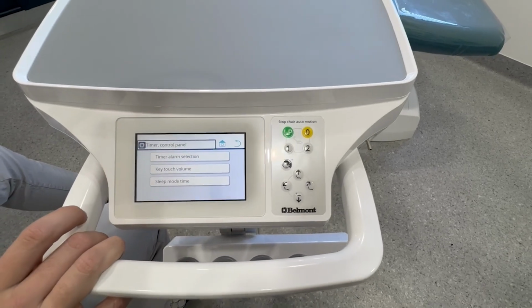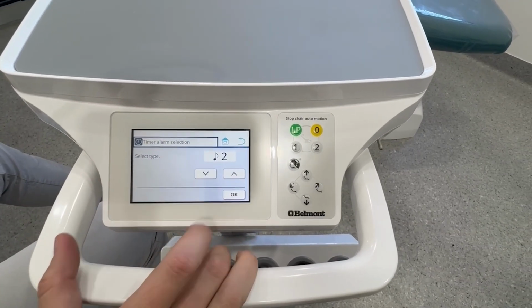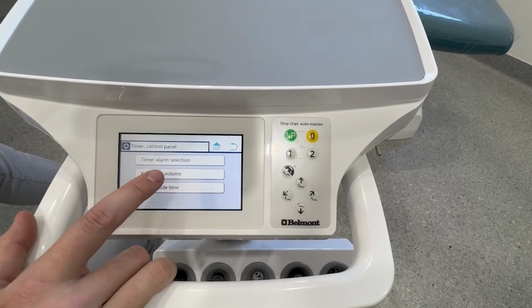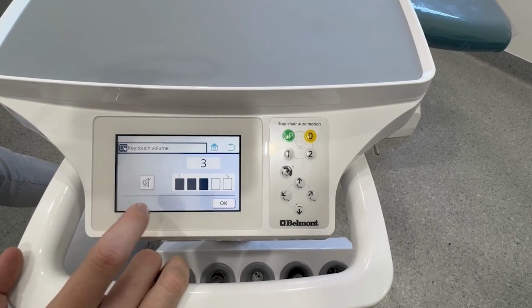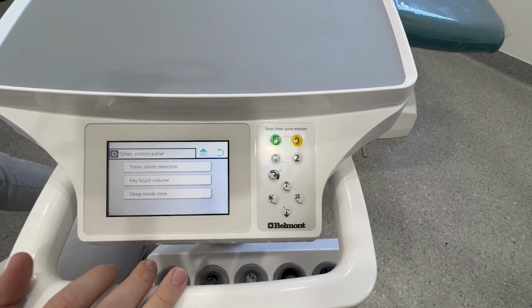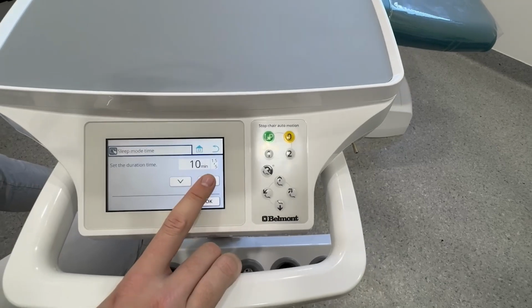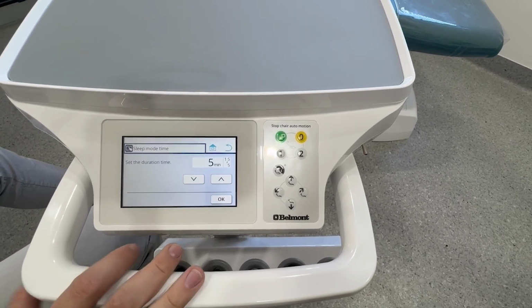panel, all sorts of things you can change there. The music, something more intense, something more romantic, so you can choose whatever you want in there with your volume. And at the bottom there, we can turn that on or off for our volume or our keypads. And we've got one more setting at the bottom of the tab, which was sleep mode. That's just the sleep mode of the panel here, so we can have that turn off after a preset time as a power saving mode.